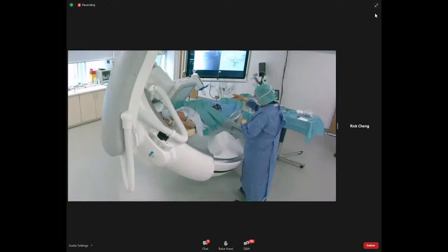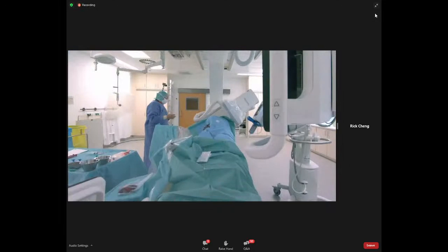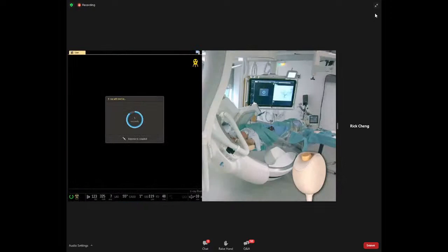The patient will receive breathing instructions and an explanation of how the cone beam CT scans are performed. Since this will be a dual cone beam CT scan, there is an interval time between the two cone beam CT scans. This can be used for the patient to breathe in between. Press the Acquisition button in the control room.